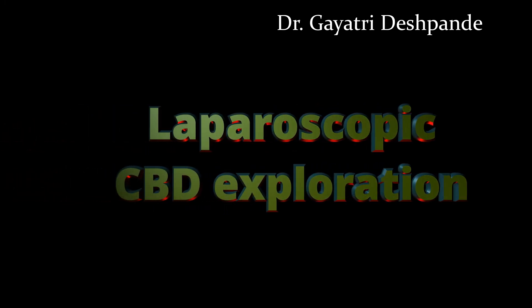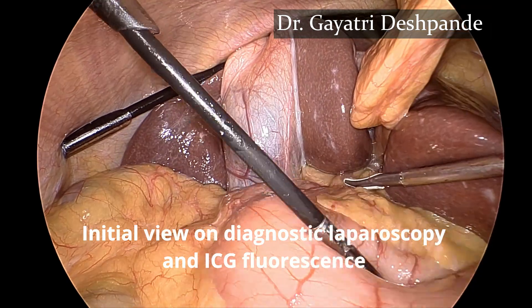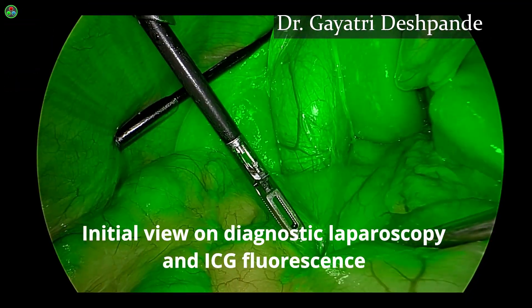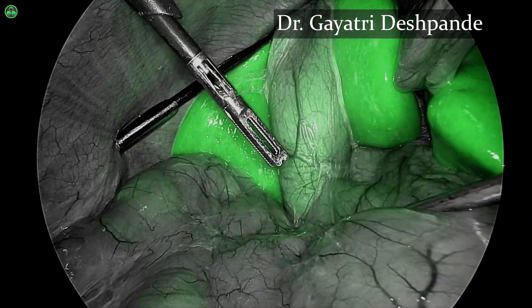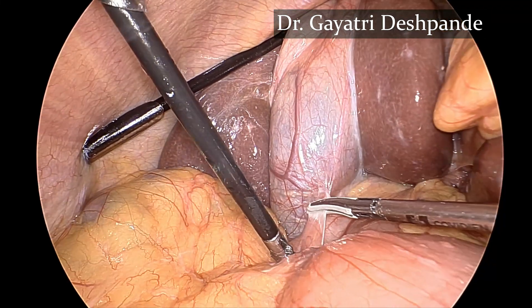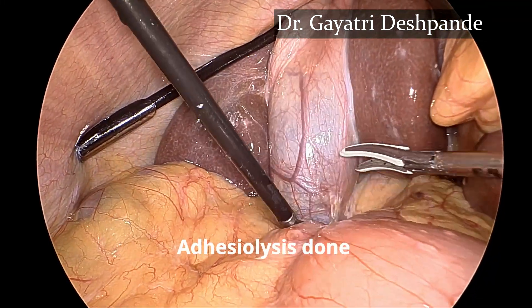In this video we shall see the step-by-step procedure to perform CBD exploration. I am using the Stryker 1788 system with the ICG mode. The initial adhesiolysis is done using an energy source, which is a good instrument to perform bloodless dissection.